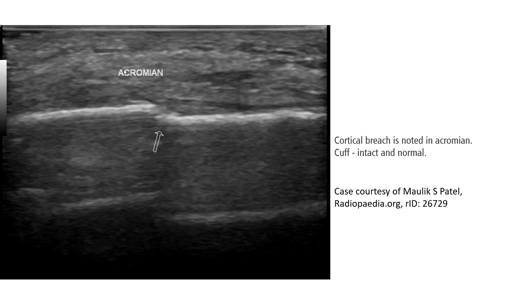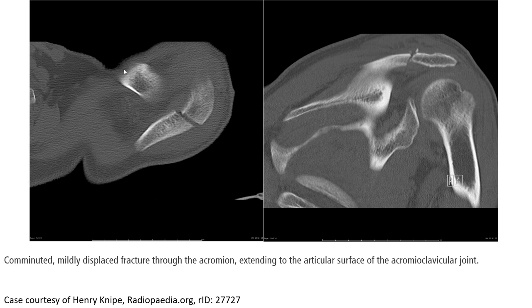This is an example of a shoulder ultrasound. A cortical break is noted in the acromial process. The cuff is intact and normal. The CT shows the acromial area with a displaced fracture through the acromion, extending to the articular surface of the acromioclavicular joint.